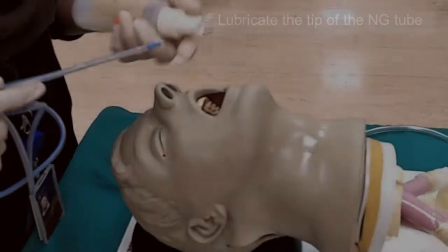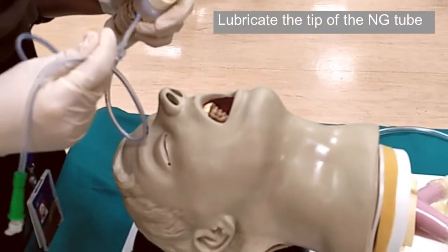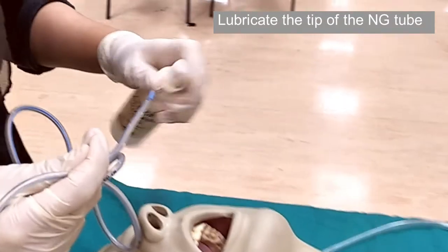Before insertion, lubricate the tip of the nasogastric tube, either with lignocaine spray or gel. If available, a local anesthetic spray can be used on the back of the throat.